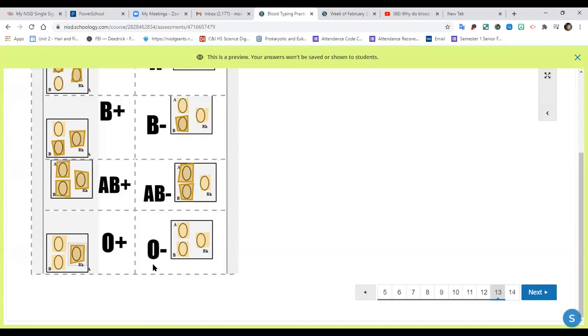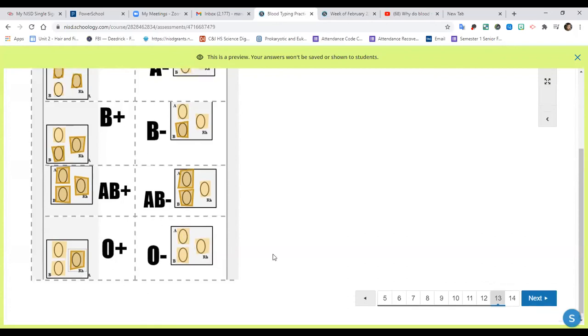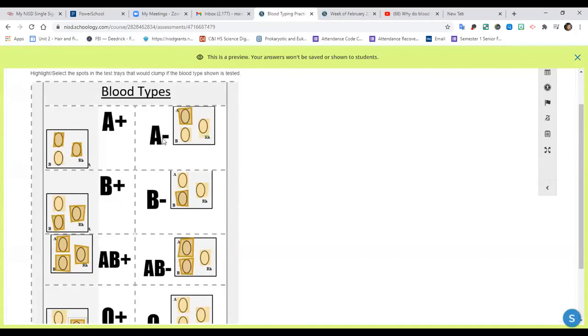That's it. Okay, so that's how you can tell on blood types, whenever you get your results, you're not gonna see this A, you're gonna just see these results. You're gonna be like, oh, it's A, and it's negative. This was, oh, it's B, and it's negative.